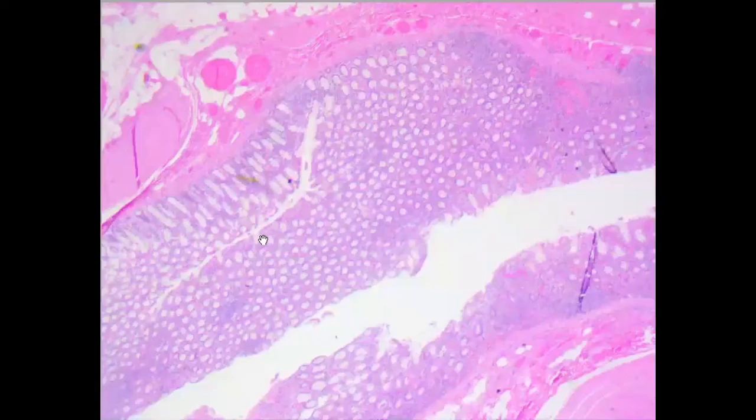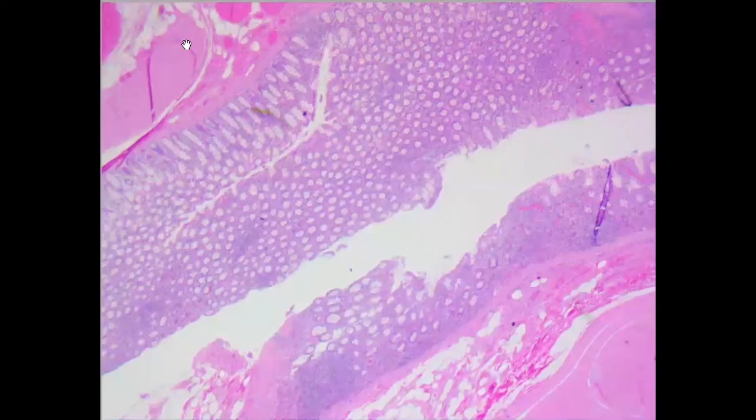Maybe it's not evident on this one, but you can see that the mucosa and the submucosa went beneath, or penetrated, this layer here. Yeah, because the muscularis propria is on both sides. So this is one piece of the muscularis propria, and this is the other piece.